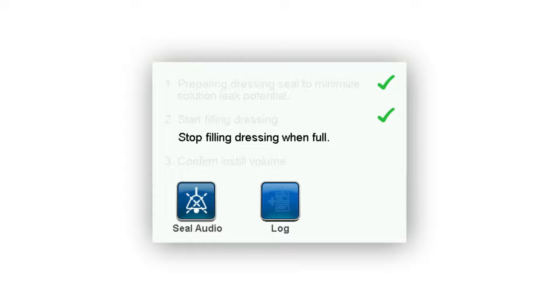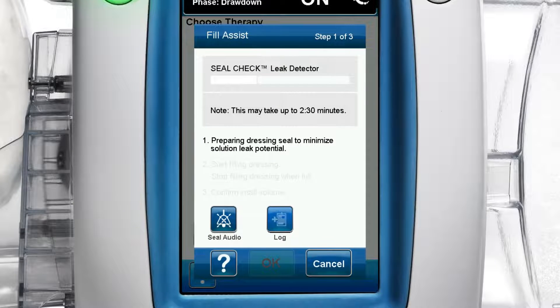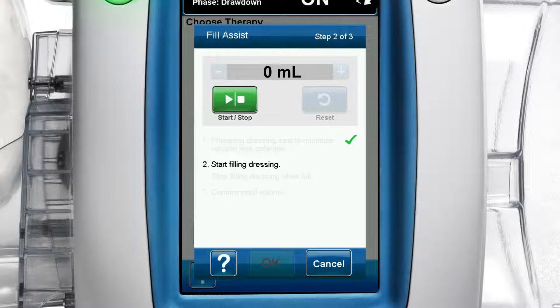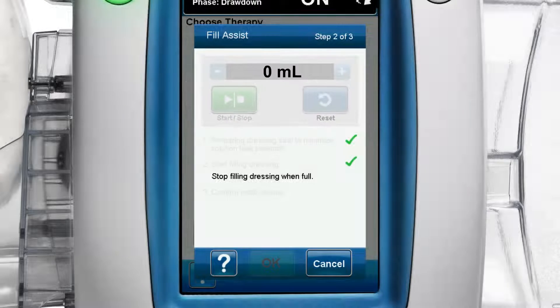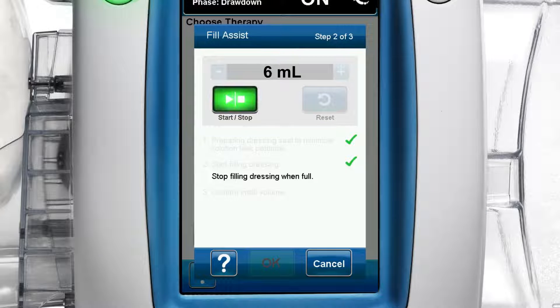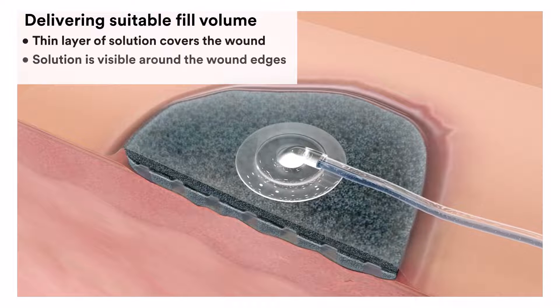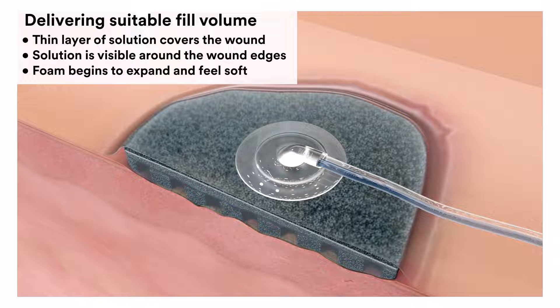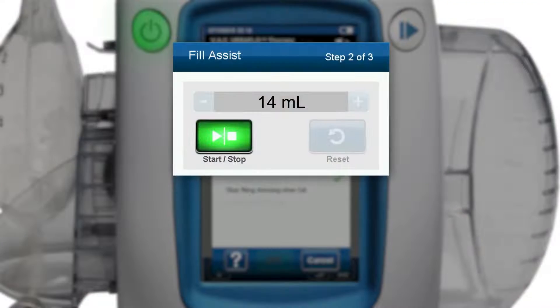A check mark appears and that task is grayed out once a task is completed. The therapy unit automatically advances to the next task and displays the next instructions, which will be visible and bolded. Once a good seal is confirmed, step two of three appears: start filling dressing. On the fill assist step two of three screen, press the green start/stop button to begin delivering solution to the wound. Monitor the wound as it fills with solution. Once a thin layer of solution covers the wound, is visible around the wound edges, and the foam begins to expand and feel soft, press the start/stop button to stop filling.